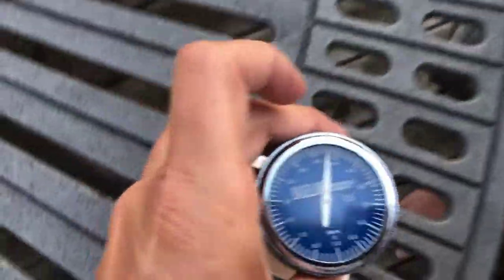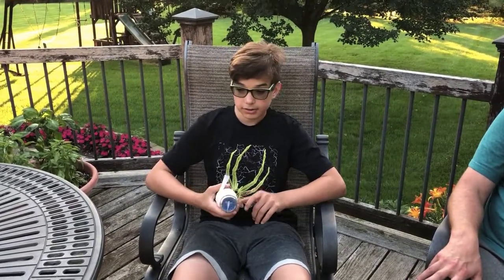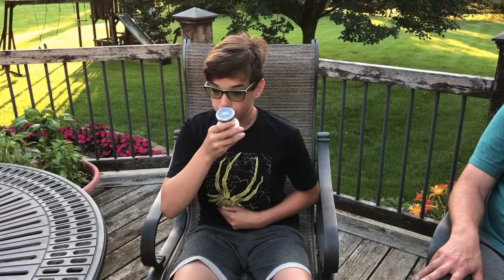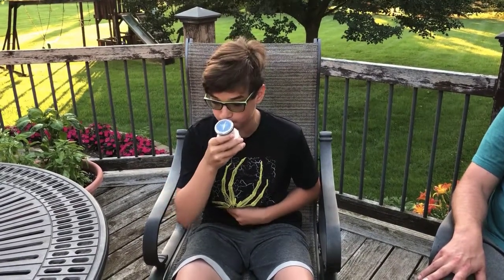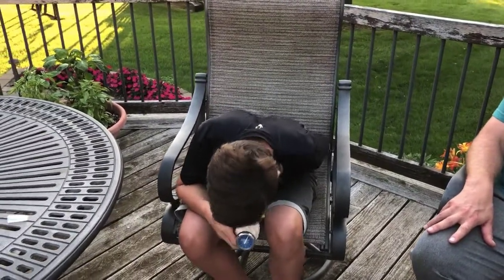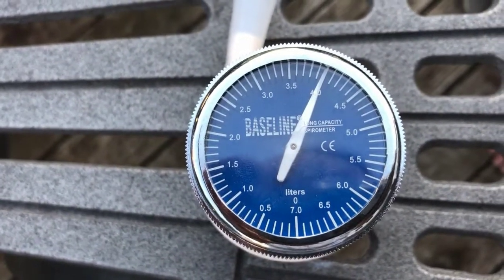How you feeling? Good. Sometimes my students get dizzy. All right, so that one was 3.8 liters. Trial number three, vital capacity. The spirometer's been reset and we're ready to go whenever you are. How you doing? Oh, good. Oh, that was the biggest one yet. So that was 4 liters.